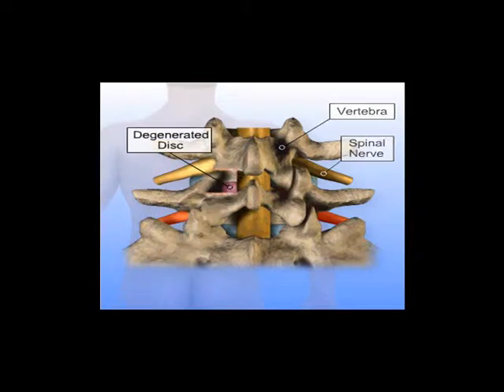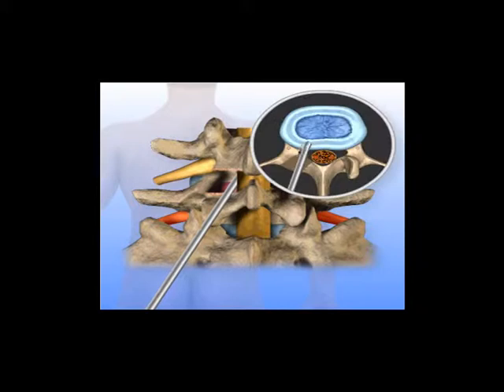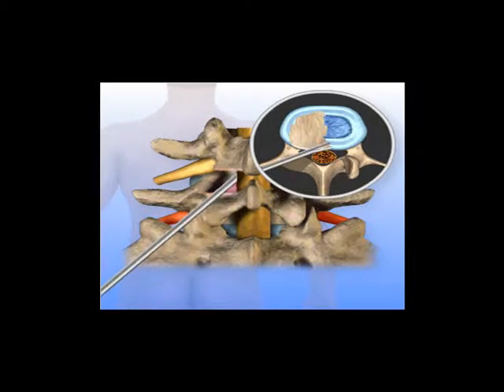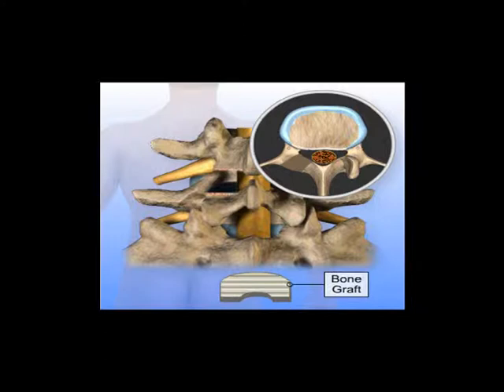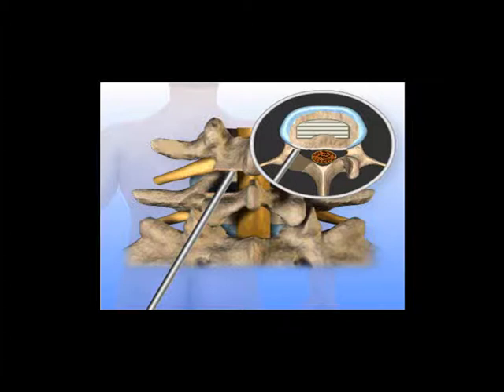A single bone graft is placed in the disc space from the lateral aspect through the area exposed when the facet joint was removed. The bone graft will provide stability to the spine when it fuses with the vertebrae above and below it. In variations of this procedure, spacers, cages packed with graft material, or ground bone graft material may also be packed into the disc space to aid with the fusion.